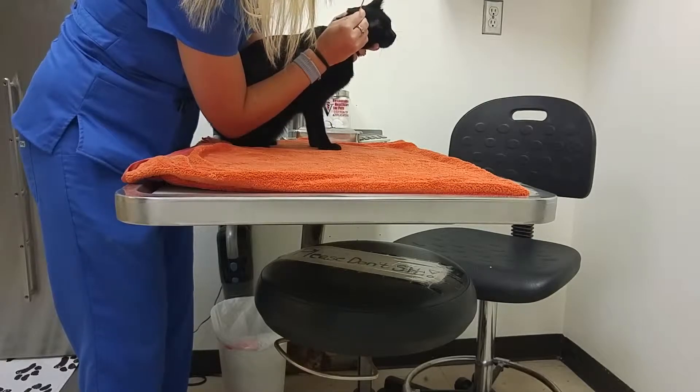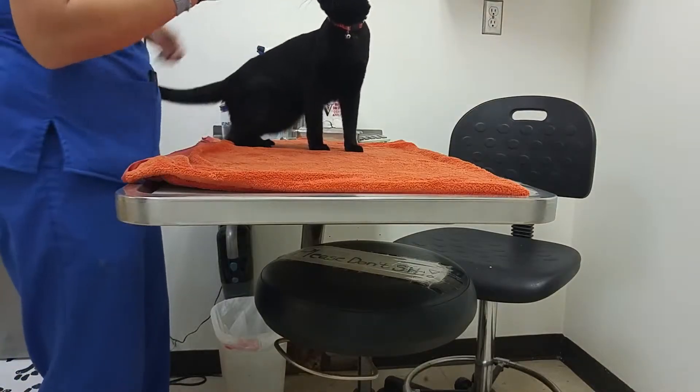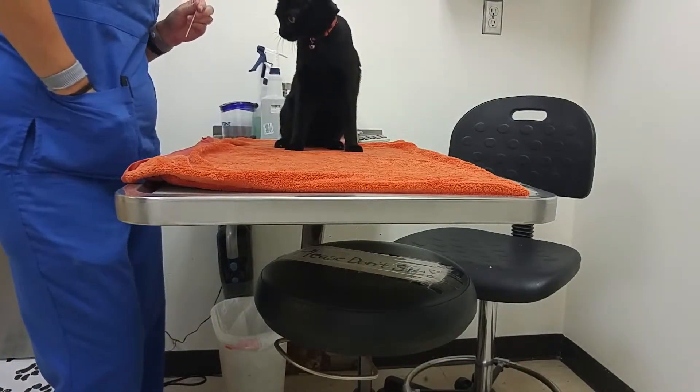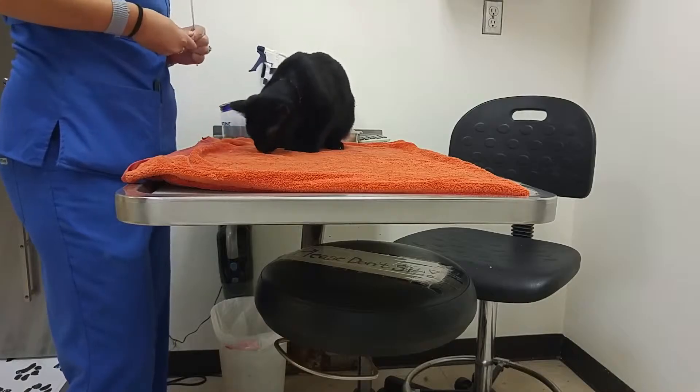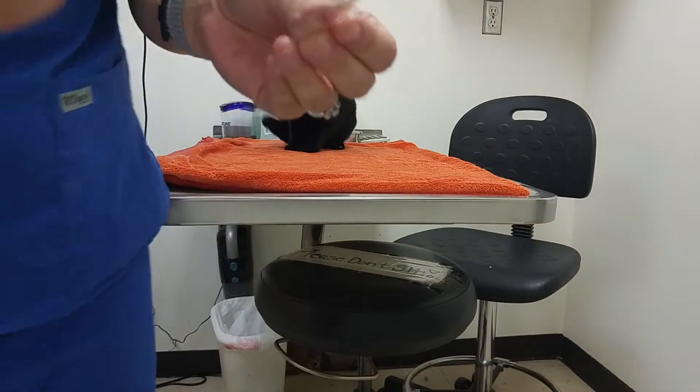It's a big ear swab on this kitty. He's scratching my ears. We're going to take this q-tip finger and we're just going to get that in there and get some debris on it. I've got some on here.